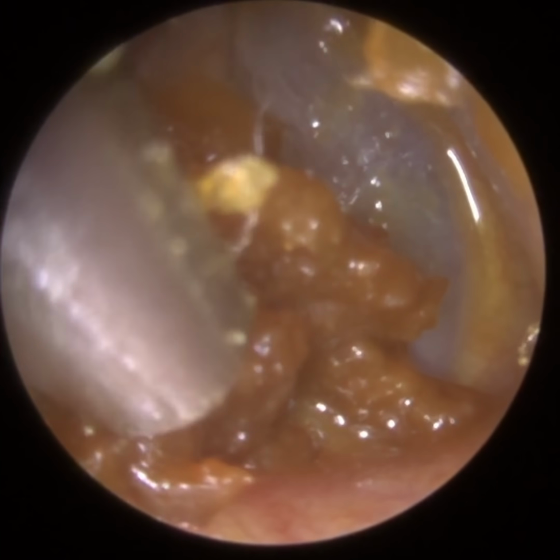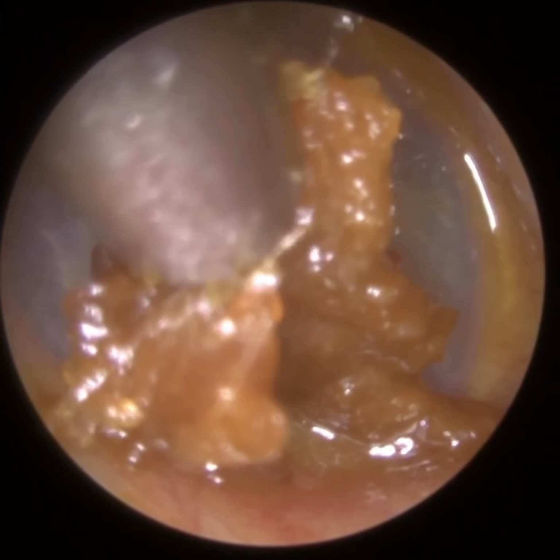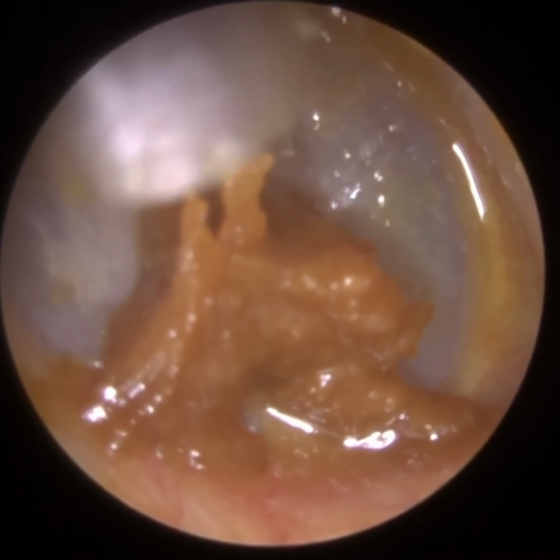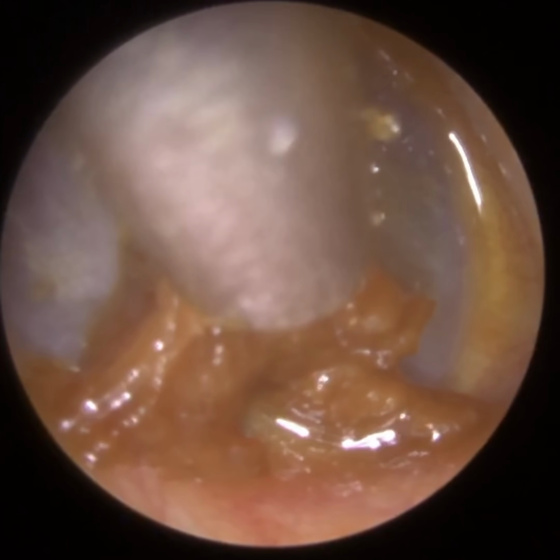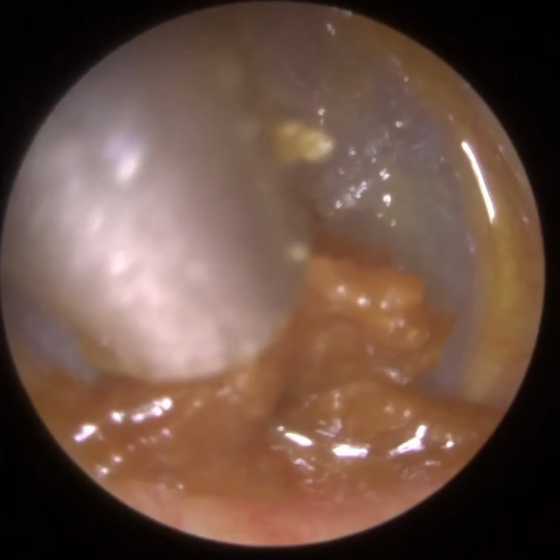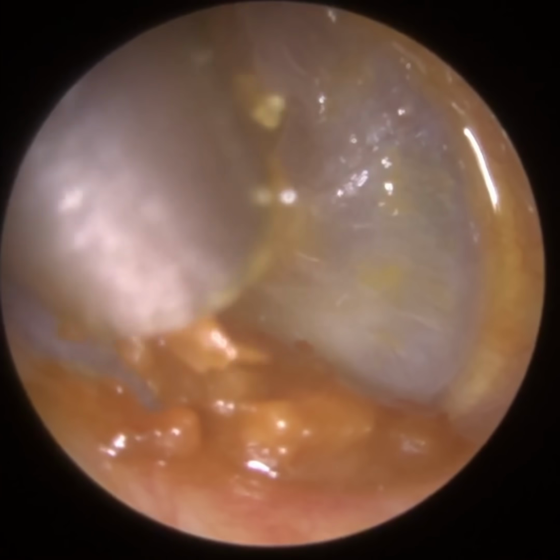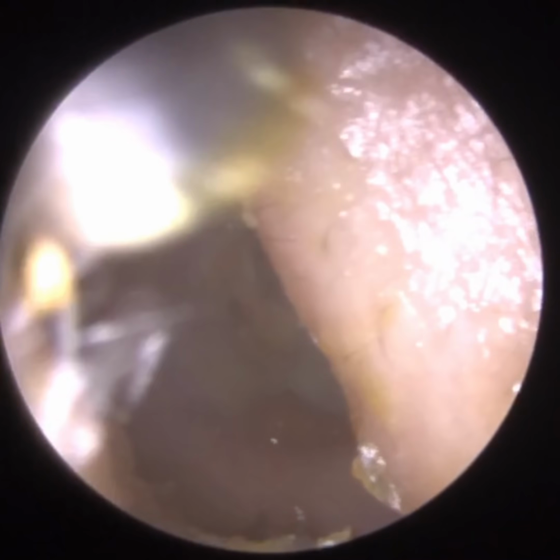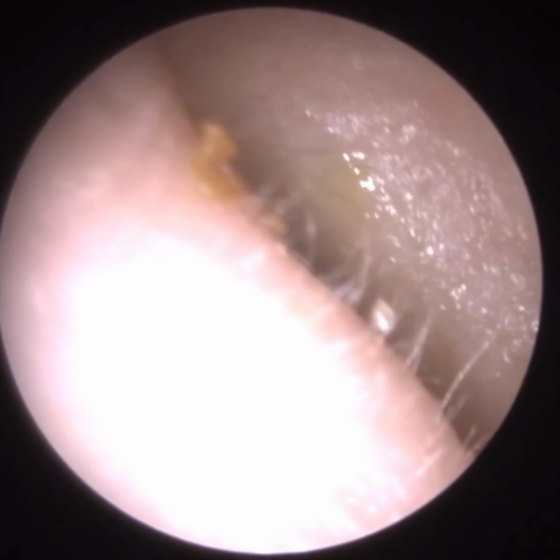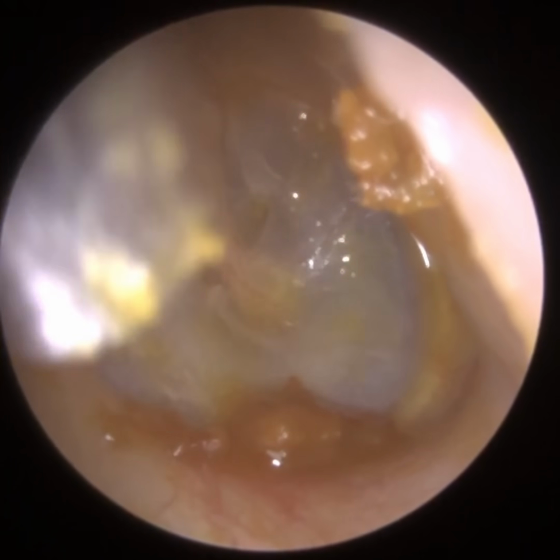So it's just this earwax in the central region and also the inferior quadrant, so the bottom part of the ear canal. And it's quite sticky, it's right on the drum. You can see there the oil drops that the patient's been using. So it's just embedded itself within the wax. So it's really gooey there. So again, the patient's symptoms are alleviated, but I'm just going to mop up that little bit of soft wax that's at the base and the inferior recess.